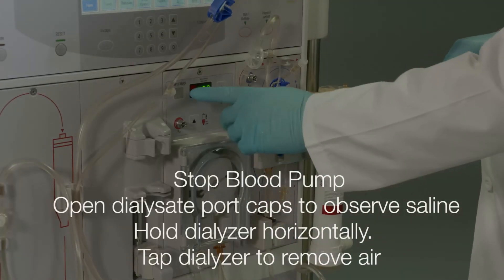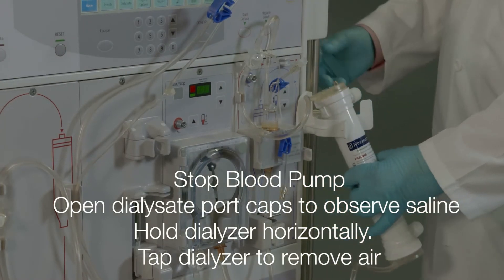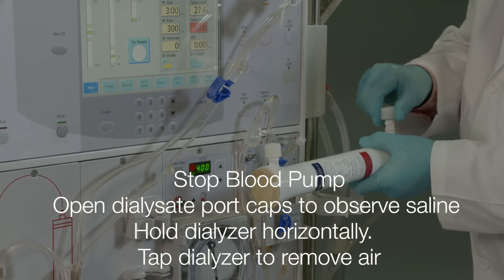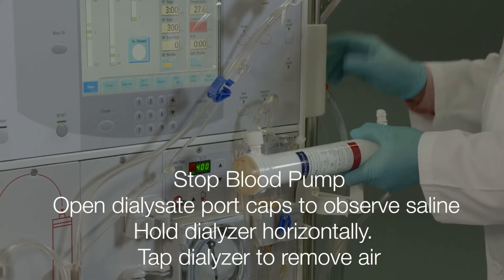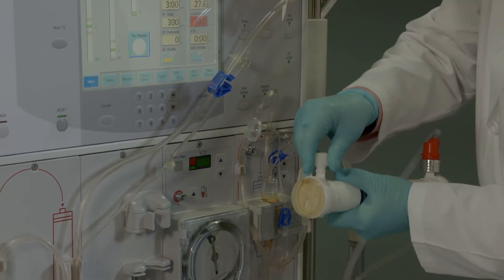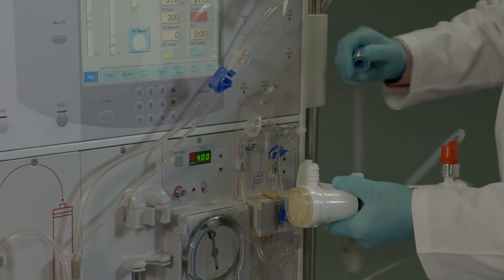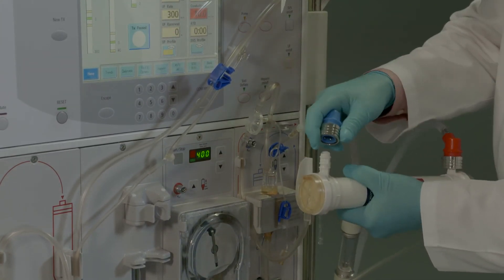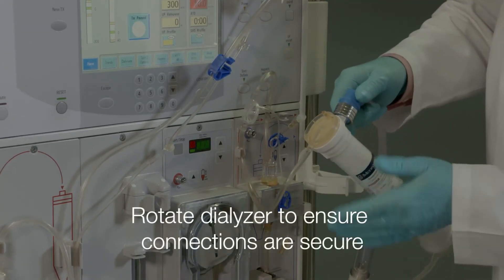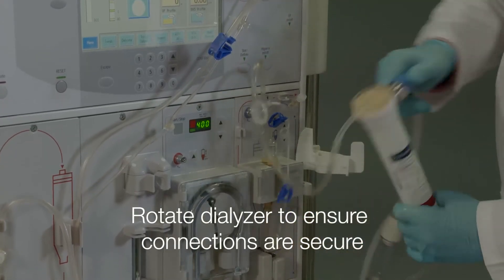When prompted to attach dialysate hoses, stop the blood pump, remove dialyzer port caps, observe saline in the dialyzer ports, and gently tap the dialyzer to dislodge air. Rotate the dialyzer multiple times to ensure connections are secure and that air has been removed from the dialyzer.